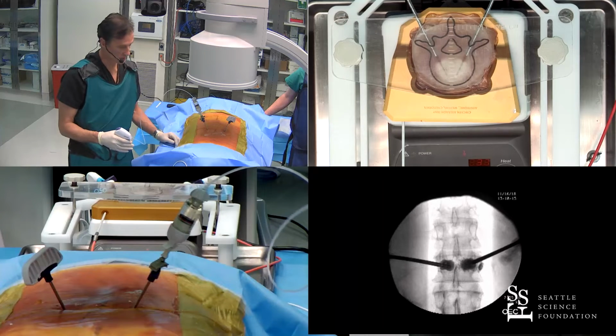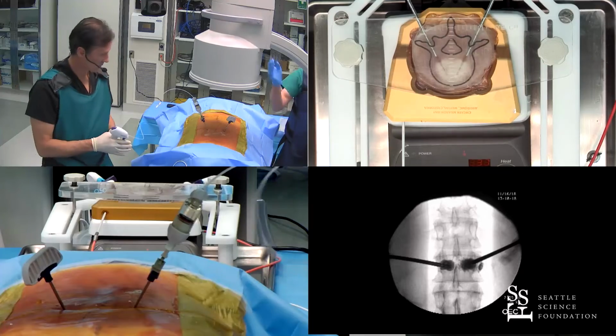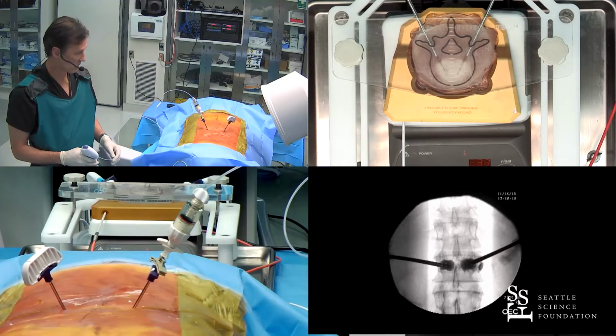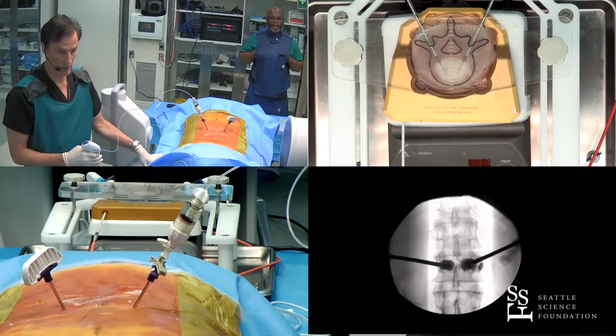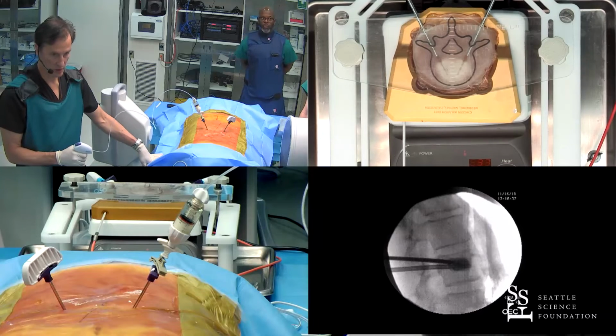So the Swiss registry data says, let's go lateral, please, that the single modifiable thing that you can do to improve pain and have persistently good pain relief is to inject more cement. And their recommendation was at least 4.5 to 5.5 cc's.